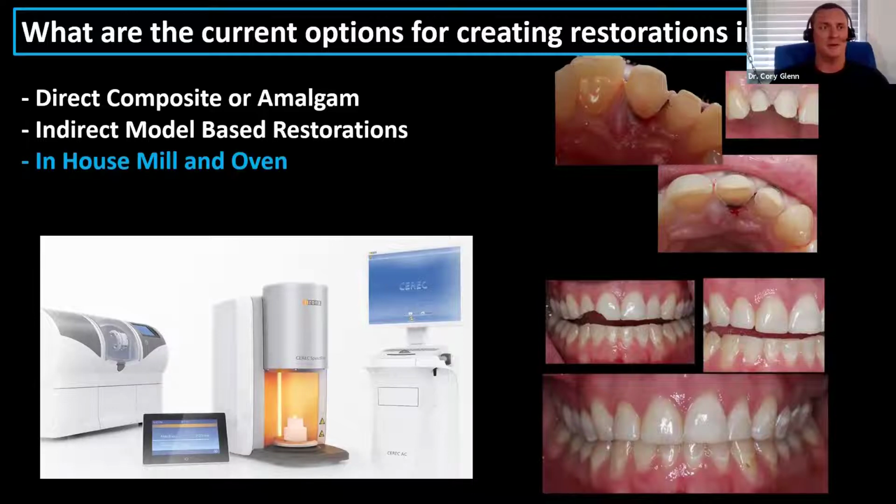That would only come into play with a cost when you're doing surgical guides, ortho, dentures, that kind of thing. So it's hard to beat free on the price. And then it would go from that into your $40,000 mill, which again is a commercial lab mill. It will do anything you throw at it. And then a sintering oven for $10,000.